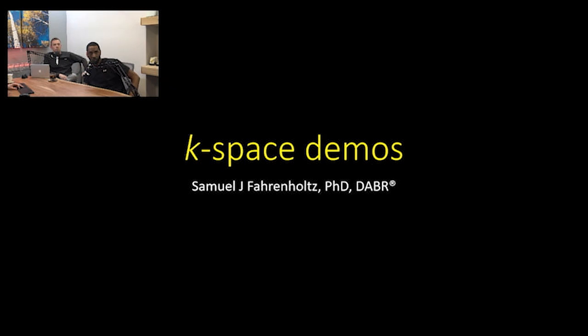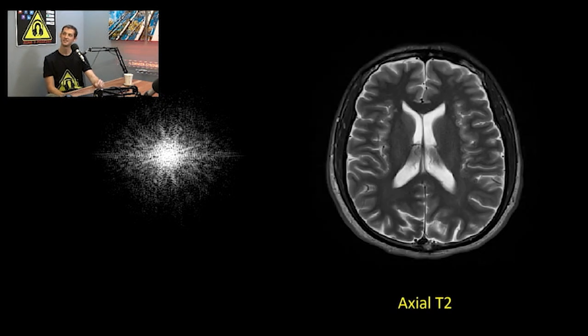Good. All right. So what is this starburst picture? The Big Bang Theory. Yes. No. Well, because we're doing a Kspace demo, it's pretty convenient to say, "Oh, it's Kspace," and you'd be right. But what image is it capturing? From our visual standpoint, it looks like a T2 axial brain. Robert is exactly right. How could you know? He must have Kspace vision. Yeah. I may have looked at this presentation just a little bit.